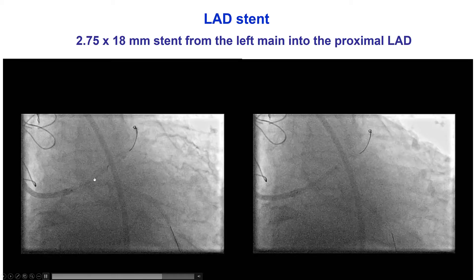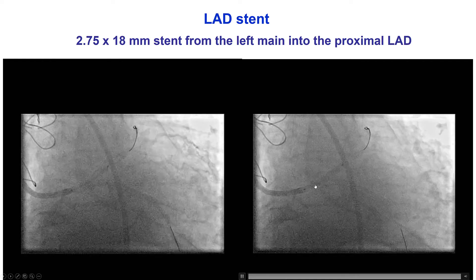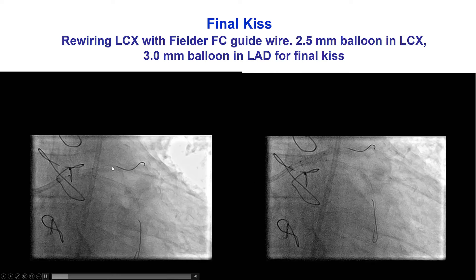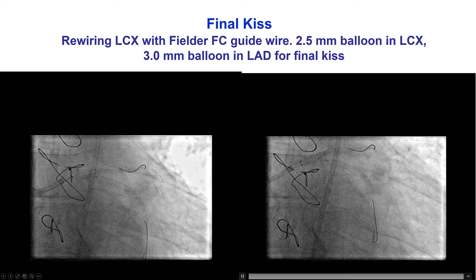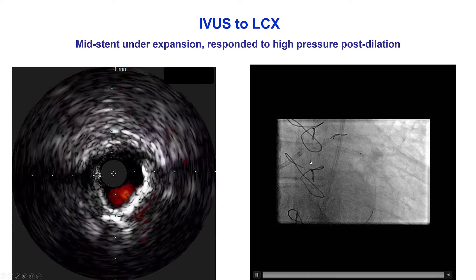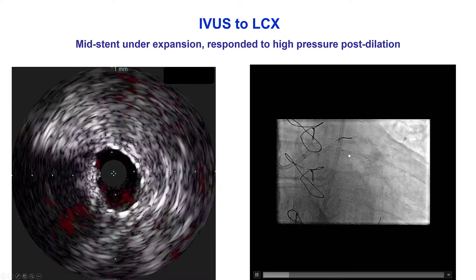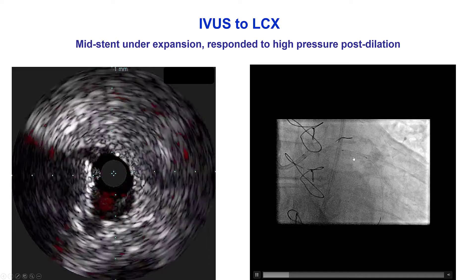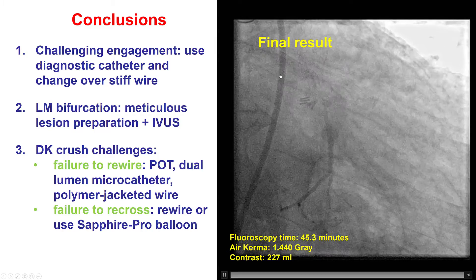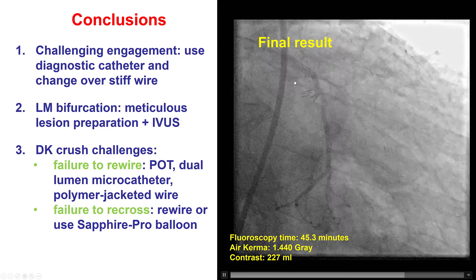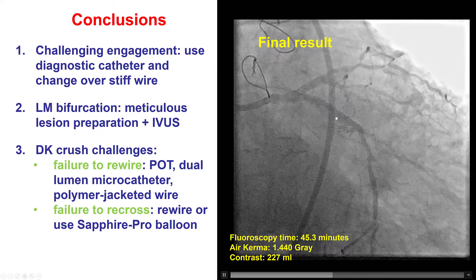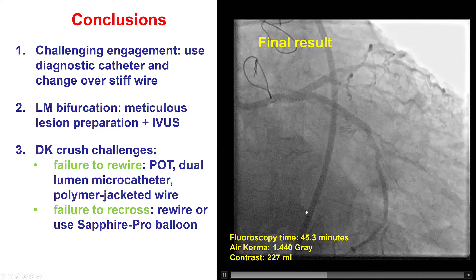We then deployed a 2.75 by 18 mm stent from the left main into the proximal LAD, then rewired once again with the Fielder FC guide wire, and performed the final kissing balloon inflation with a 2.5 mm balloon in the circumflex and a 3.0 mm balloon in the LAD, providing a nice result. IVUS showed some stent under-expansion in the circumflex, so we post-dilated with a larger balloon. After that, we had a nice final result with good flow in both the LAD and the circumflex. There was some diffuse disease more distally, but we decided not to pursue further treatment, and the patient had relief of his angina.